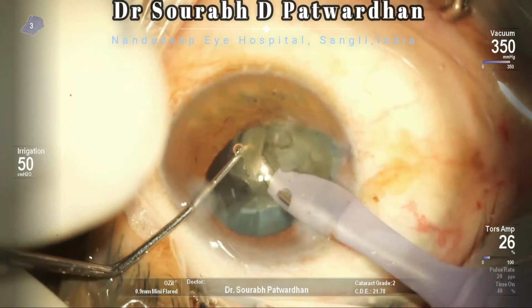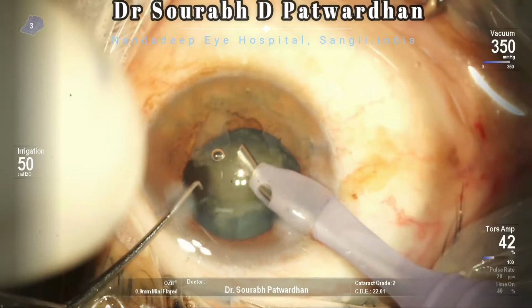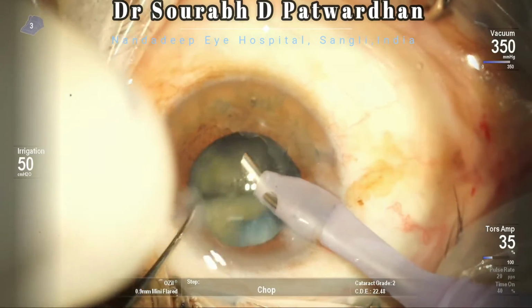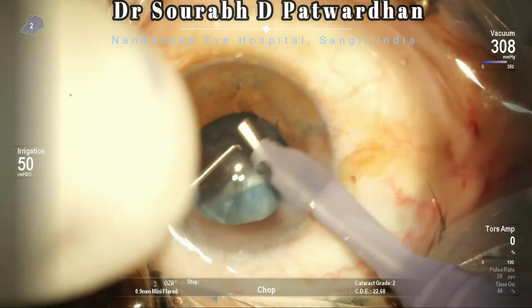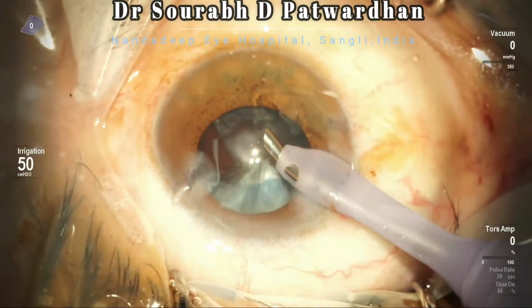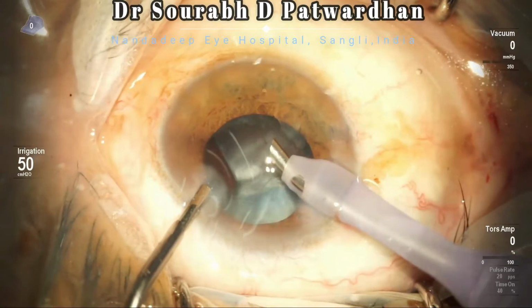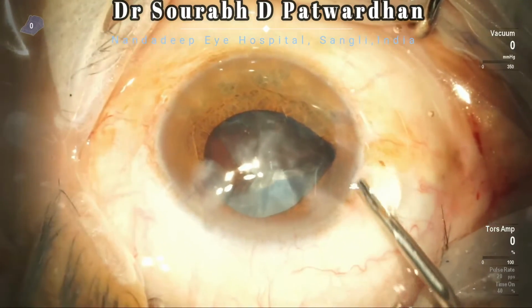The Phaco has to be used very carefully. I have already filled the anterior chamber with Hylucoat, which is similar to Viscoat, and protects the endothelium. The foot switch control has to be good. You have to give Phaco only when the tip is occluded by the nucleus, and be very careful in the anterior chamber to avoid any jerky, extensive movements. And always remember, when you take out the Phaco probe, you have to use the same maneuver as in case of a PC rent, where we inject the viscoelastic from the opposite side port. Before coming out, stop the irrigation, keep injecting.